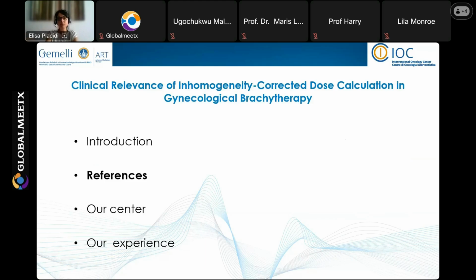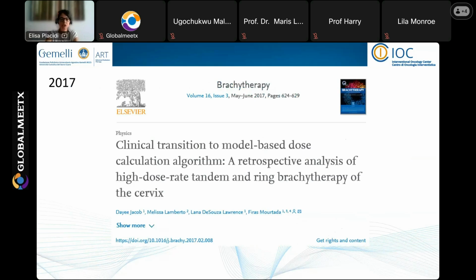So I'm going to show you now some references, and then I'll talk about our experience. References, because since the introduction of these new algorithms, there have already been quite a few publications, and this is one of them, in 2017 in Brachytherapy Journal. It was a retrospective analysis of high dose rate tandem and ring. Tandem and ring is a specific applicator for gynecological treatments of the cervix.